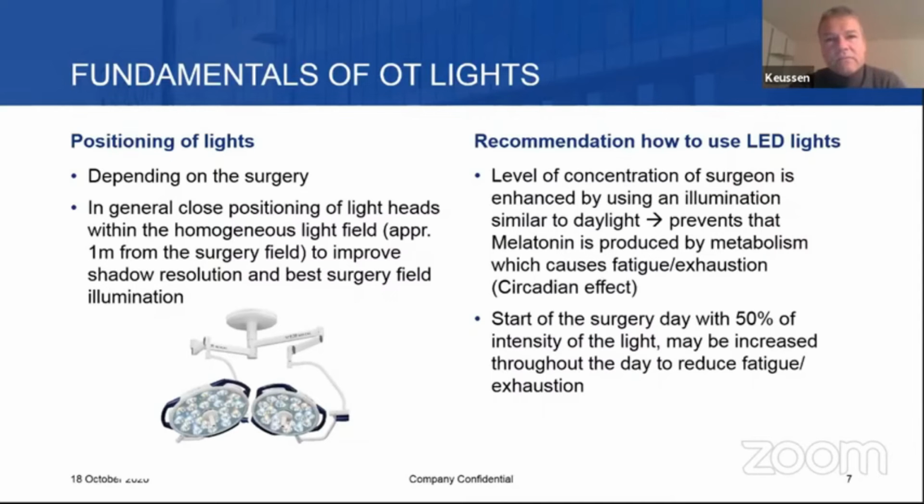Another topic is that during the day, many surgeons are exhausted, because LED lights especially are quite bright compared to halogen lights. Overall, we know that the level of concentration of a surgeon is enhanced by using illumination similar to daylight. So, as I said, 4,500 Kelvin. This prevents melatonin from being produced by metabolism, the circadian effect that causes fatigue and exhaustion.